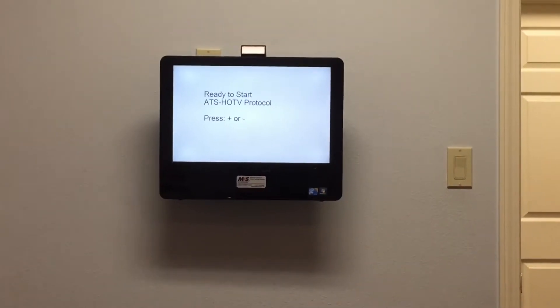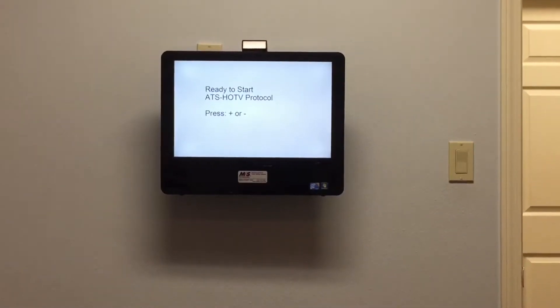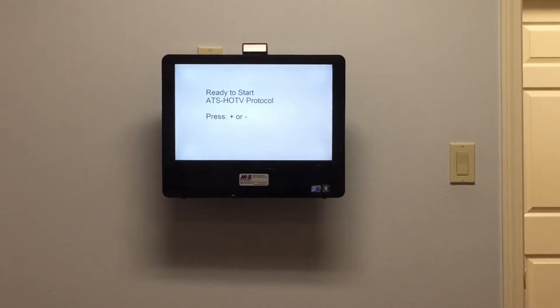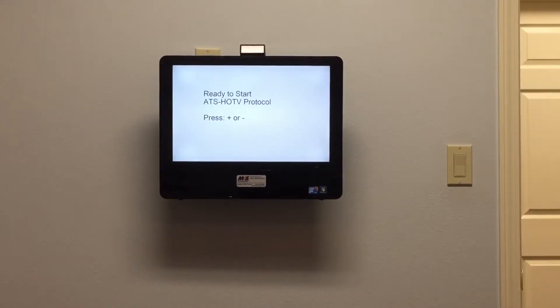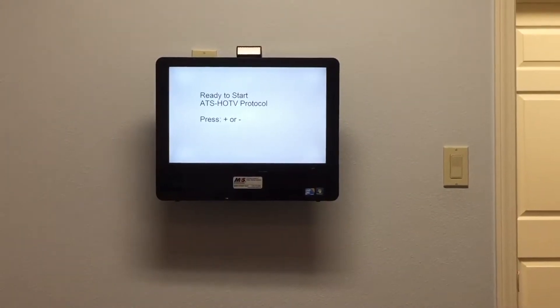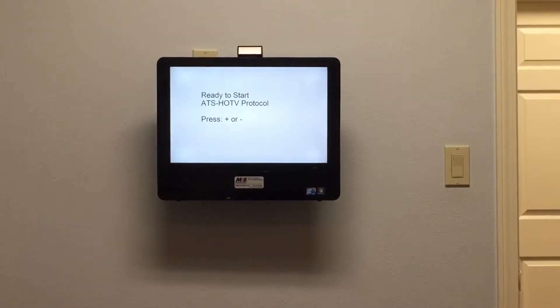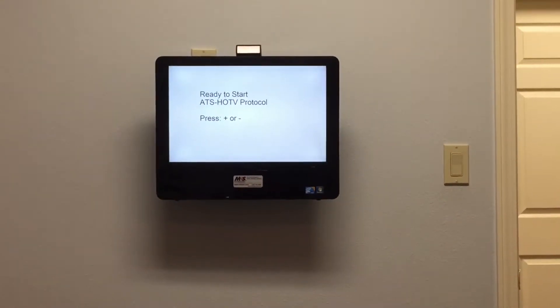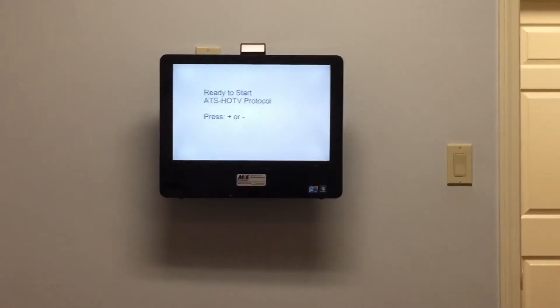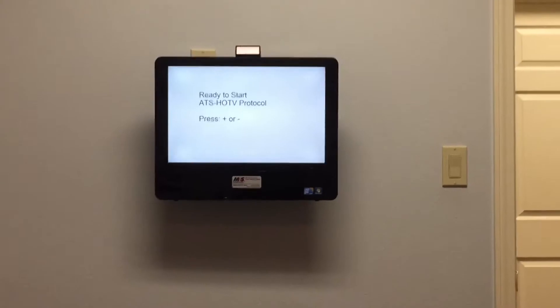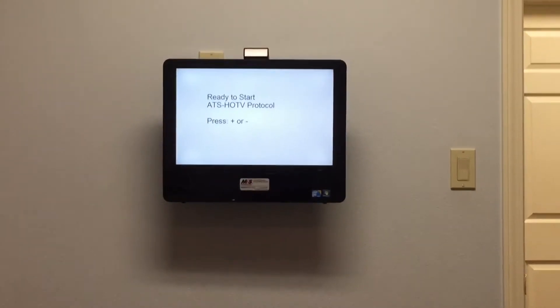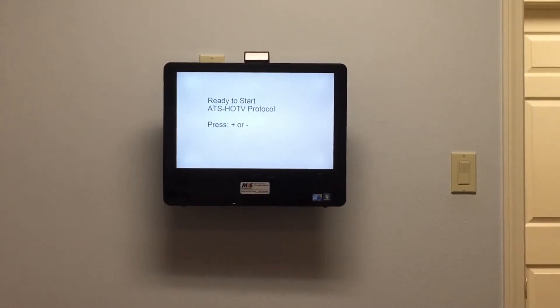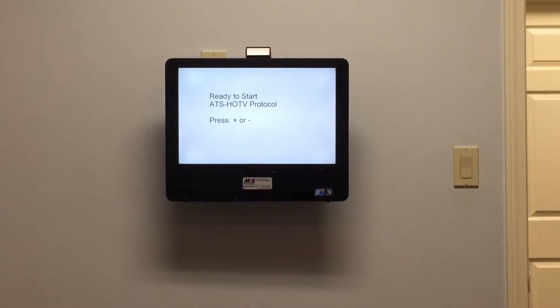So this is how we take our acuities for our patients that we're following up, managing for eye drops or patching because their eyes are underdeveloped. If you come in, this is how we'd always check it. The reason we check it like this is because we want to make sure that it's as accurate as possible each time you come in.